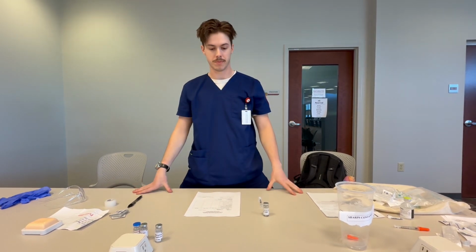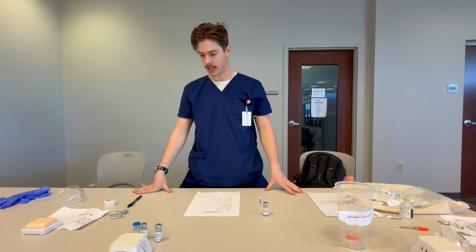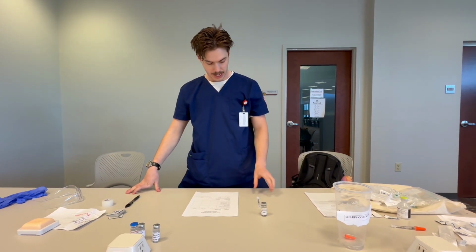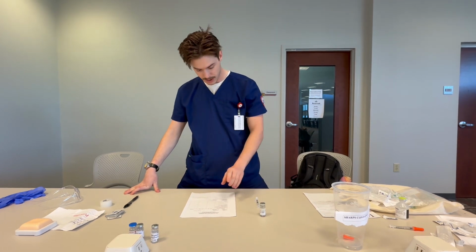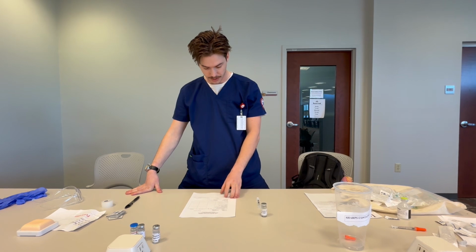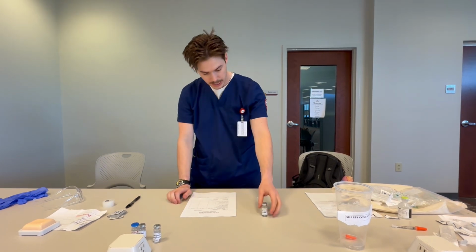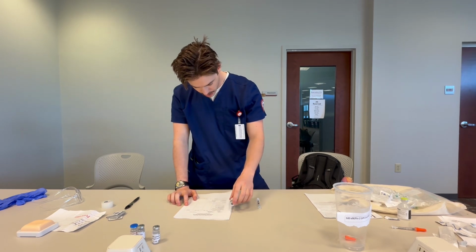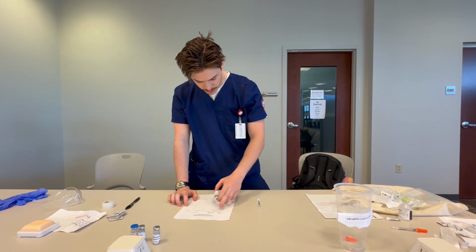And now I will begin my second check of accuracy. All right, so on this one, I have first off, Jaguar J. Jones, yes, medical record number 4176352, that's correct. The right drug, I just pulled from this bottle of Novolin R regular insulin, that is what he is prescribed here.